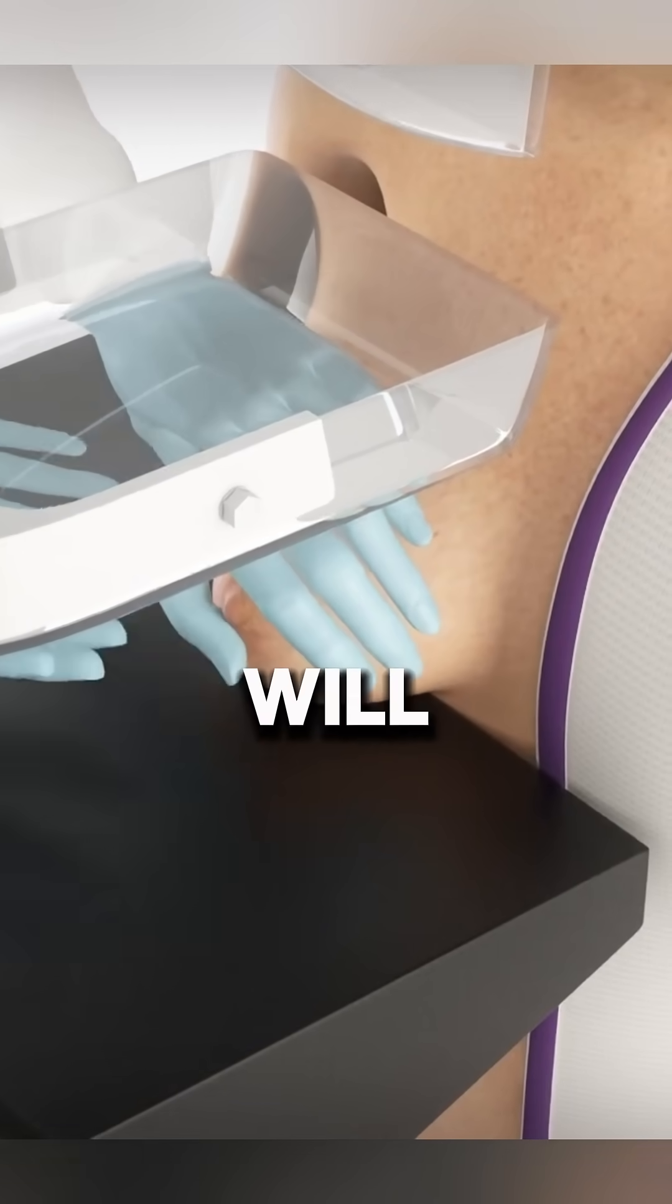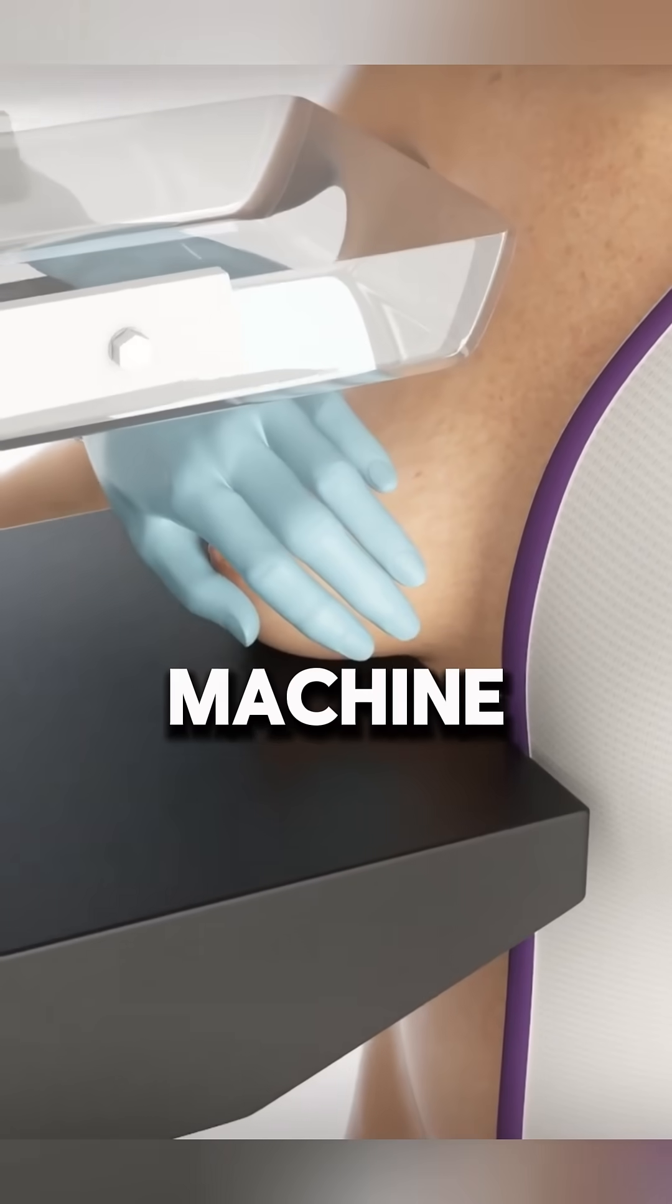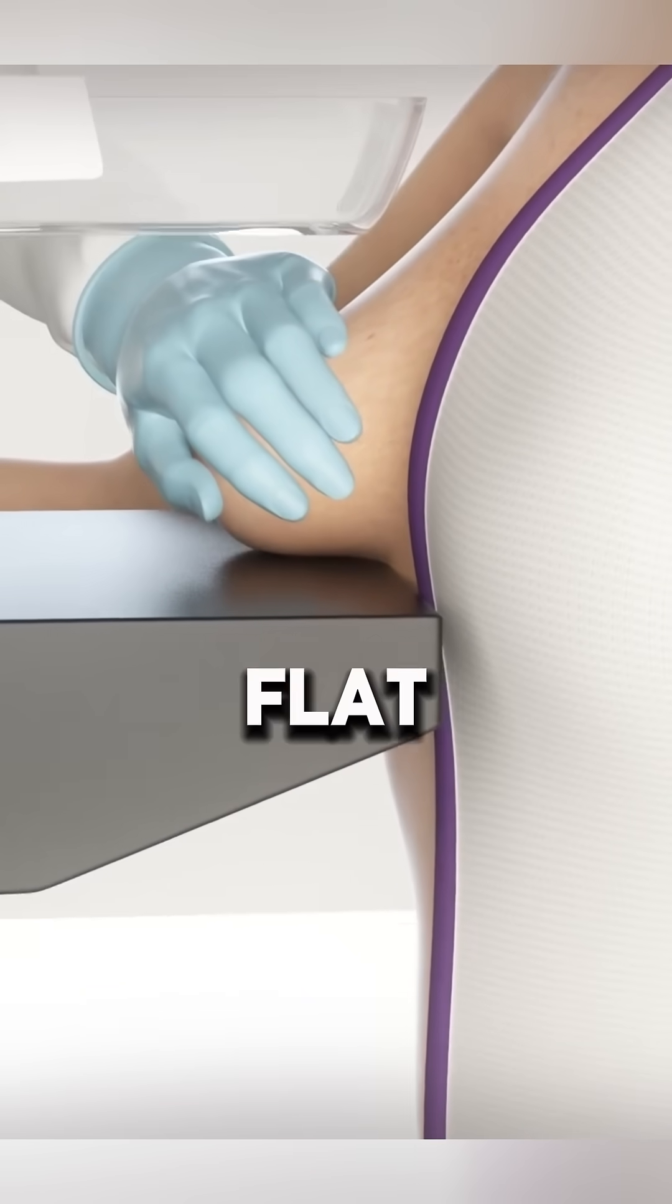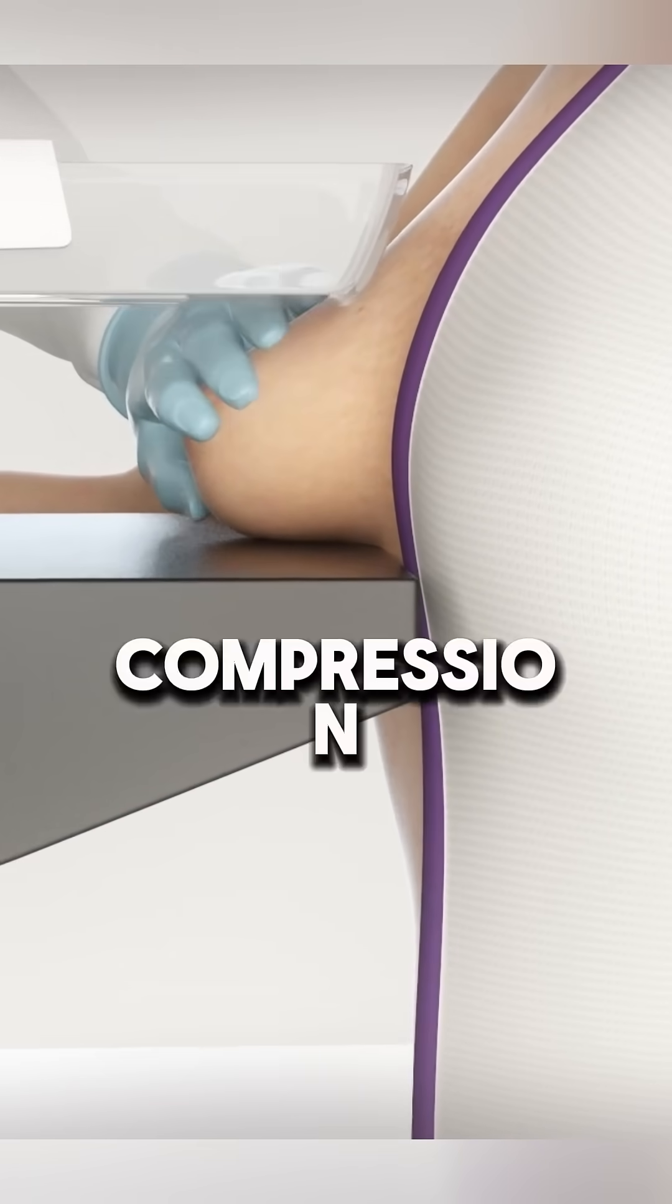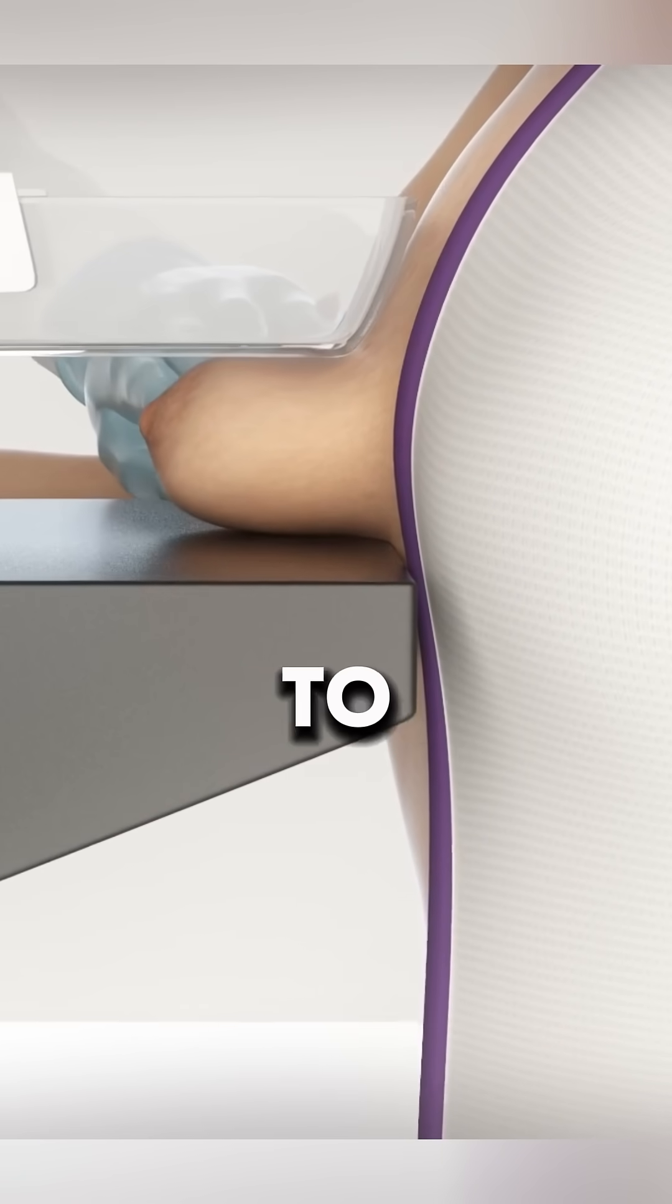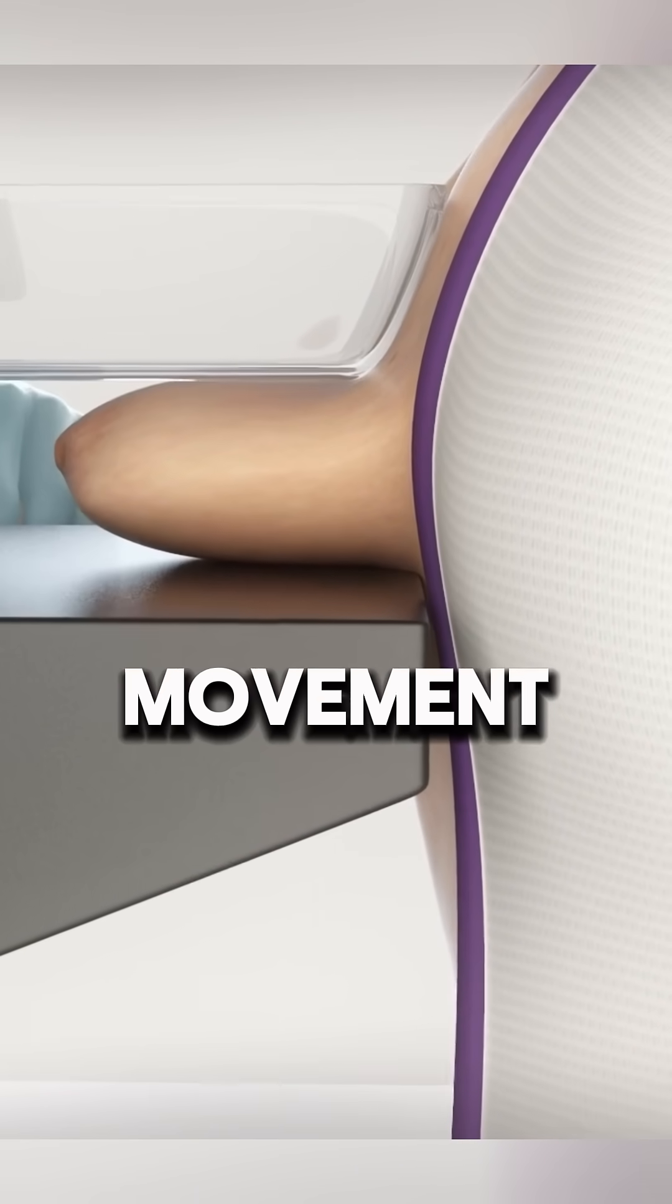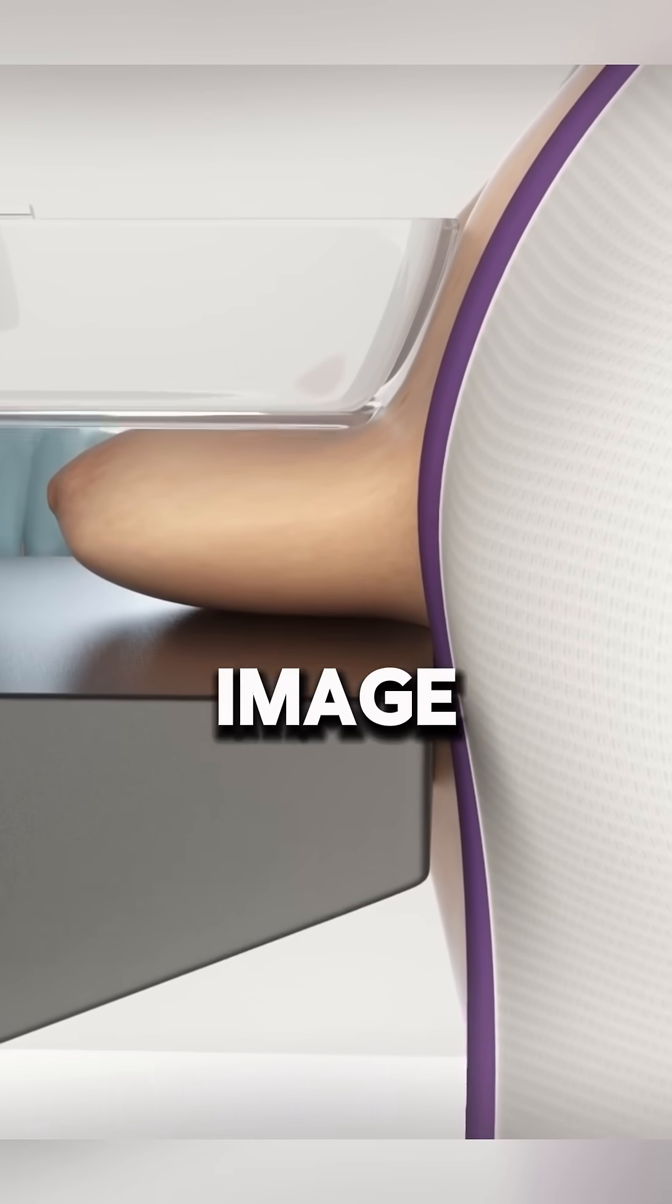During the exam, you will stand facing the mammography machine, and one breast at a time will be placed on a flat surface. A compression paddle will gently press down to spread the tissue evenly and minimize movement, ensuring a clear image.